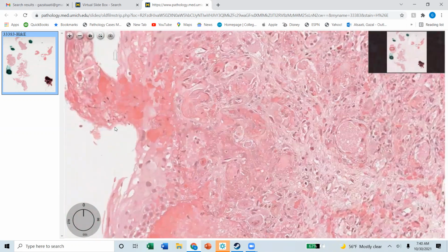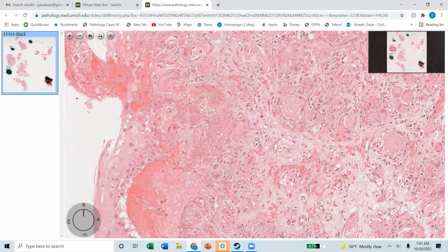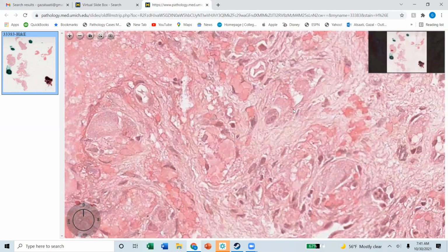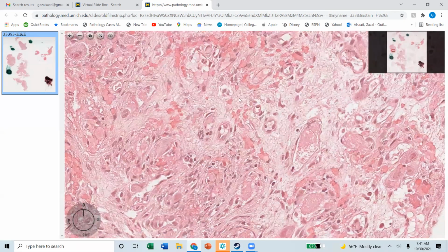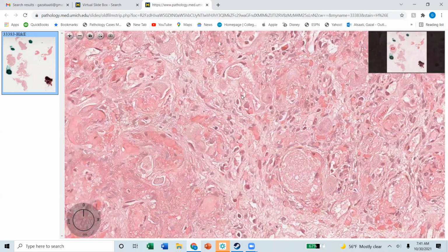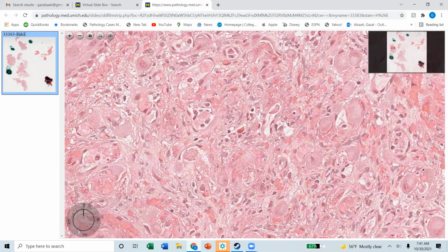All right. Now we know that it's CMV. Let's see if we can see the CMV. If you got a positive CMV, how many of you go, oh, this is a positive CMV, this one.